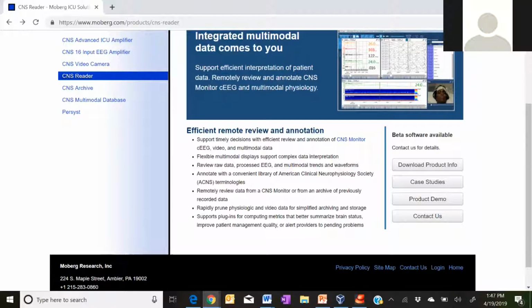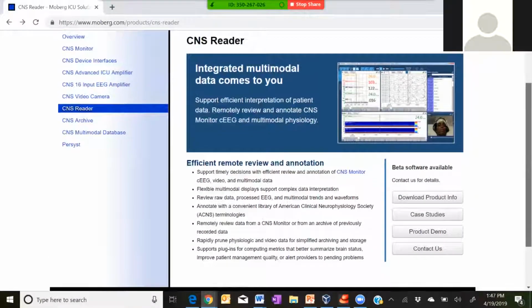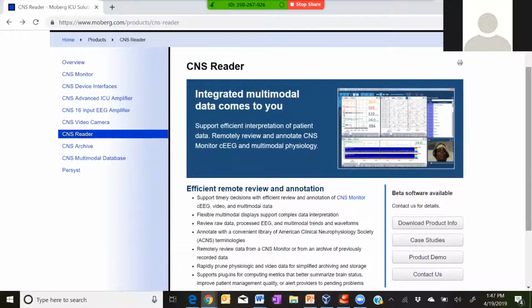So it really can be flexible and customized to include as many different panels of information as you want. So if you only want to look at vitals, you can just have a panel that gives you vitals. So in this little screen, you can see where the patient is down in the bottom right-hand corner, and then you see that there's an event list above that. Probably you can appreciate that, those of you who've looked at the monitor a lot.